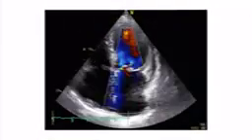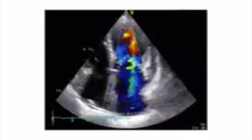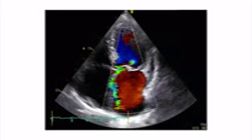Is mitral regurgitation severe? Is this his problem? Clearly there's a jet. But how do we quantify this, and what is the meaning of this echocardiogram? Let's take a short look at the jet.